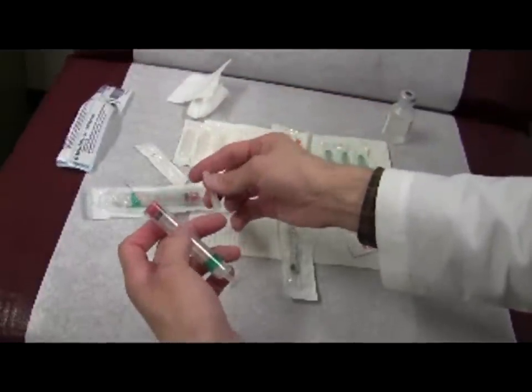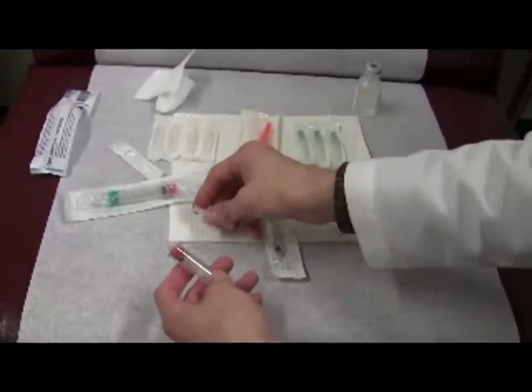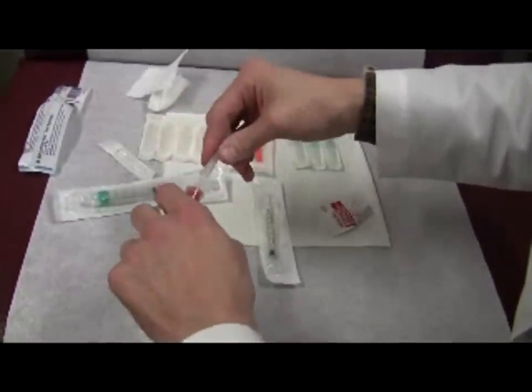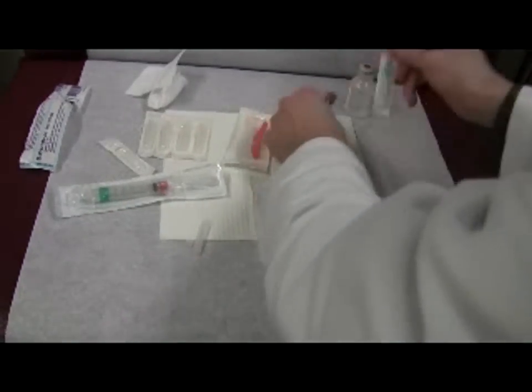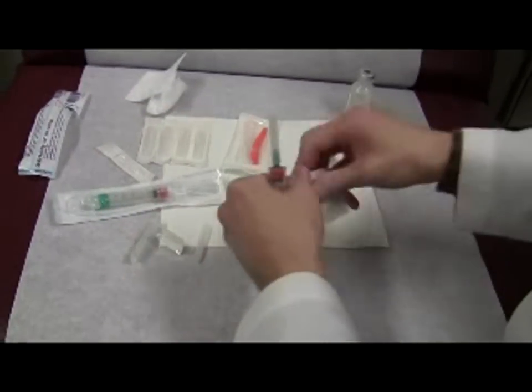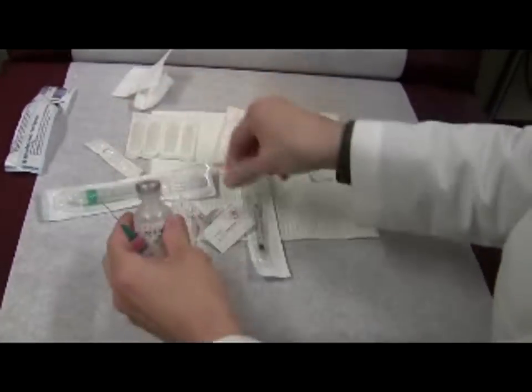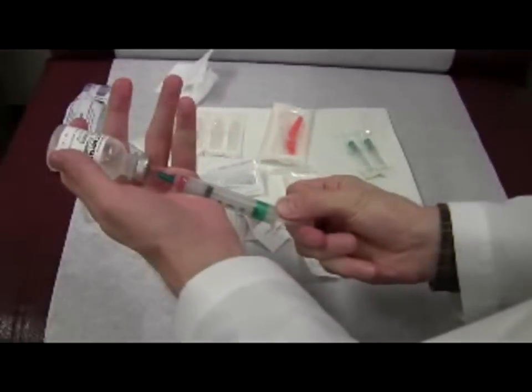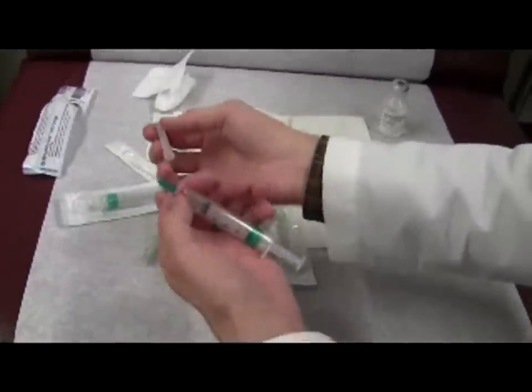When recapping a needle — often when drawing up medicine, a large bore needle is used to draw and a small bore needle is used to inject. So for example, this is a larger bore needle, and I clean the top of the medication. Drawing up medicine is a whole other exercise, but I drew up medicine with a large bore and maybe I want to inject it with a small bore.